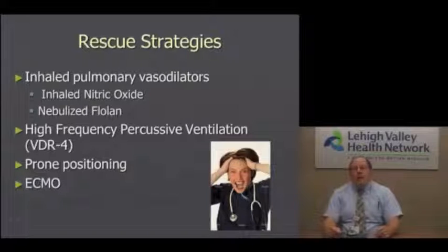Now, we have a fair group of patients who end up having problems with oxygenation, or conventional ventilatory strategies don't work, in the sense that they may remain hypoxemic or they may remain hypercarbic despite using conventional ventilatory strategies. So we do have an array of options and interventions available, and I'll talk a little bit about them. We'll go into more detail later in this lecture, or the second part of the lecture, but I just wanted to bring this to the forefront now.